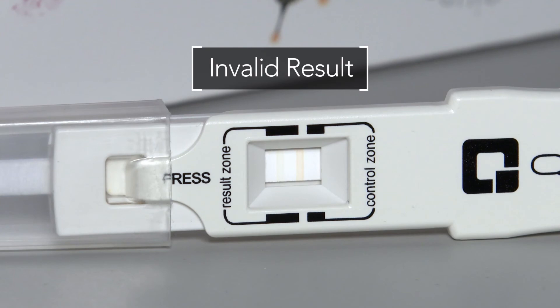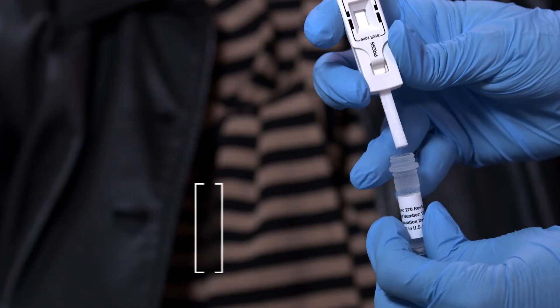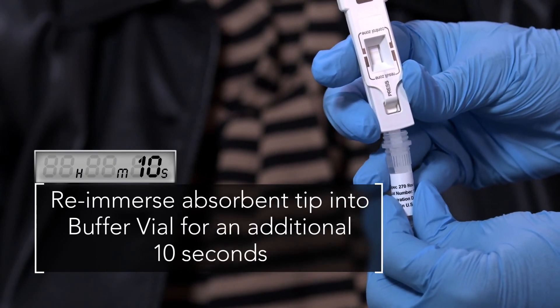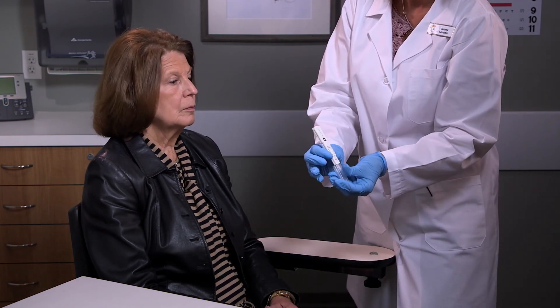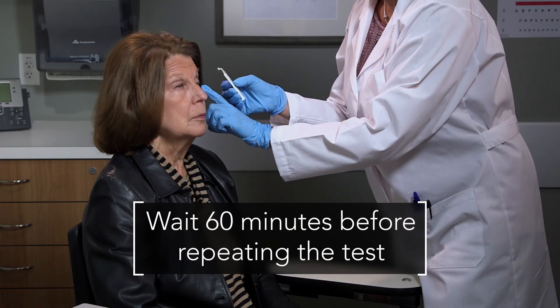If a blue line does not appear, the test may be invalid. Re-immerse the absorbent tip into the buffer vial for an additional 10 seconds. If a blue line still does not appear, the test must be discarded and the subject retested by resampling the eye using a new Adeno Plus test. If a second sample is needed, the sampling may be repeated 60 minutes later.